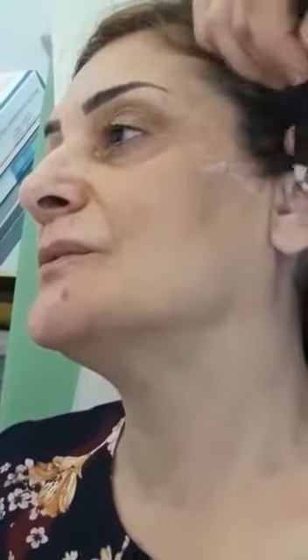Then consider that the insertion point for the jawline, even if we are not doing it with this patient, is here in front of the tragus. Then consider separately the midface and the lower face.